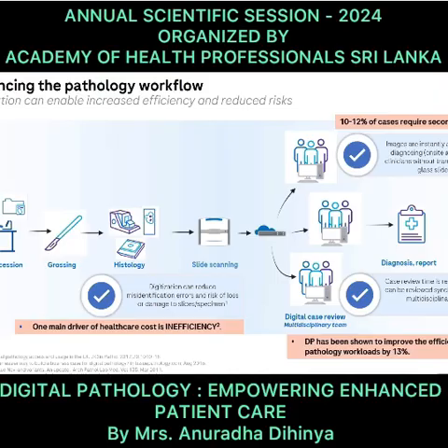Now, how can digitization help? Basically, digitization can reduce misidentification errors and the risk of loss or damage to the slides or specimens. If the specimens or slides are not barcoded, mislabeling can happen, and due to mislabeling, misdiagnosis can happen. With digitalization, these errors can be reduced.